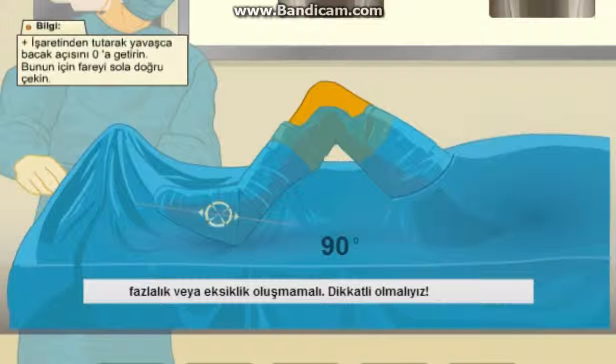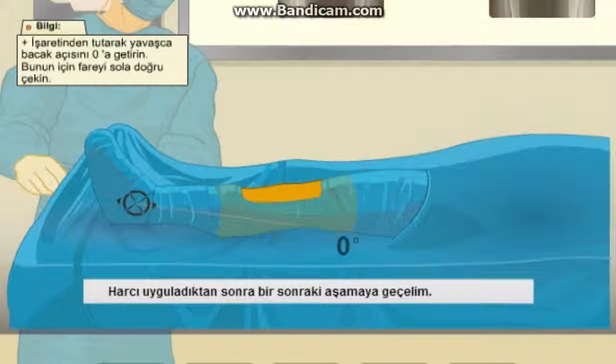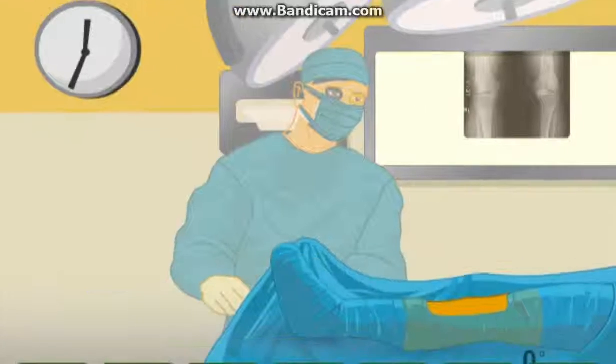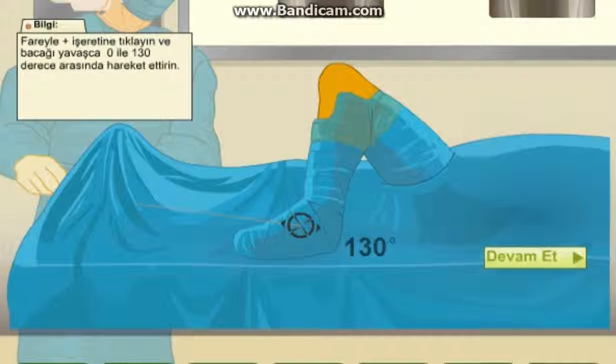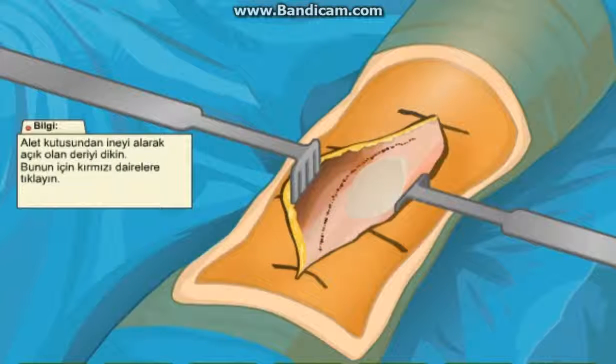Lay the leg flat on the table so the new knee components put pressure on each other. This allows the bone and components to bond with the cement. The cement can take anywhere from 10 to 15 minutes to harden. We perform our range of motion tests one final time. Our patient's new knee is looking good. Let's close up the incision.